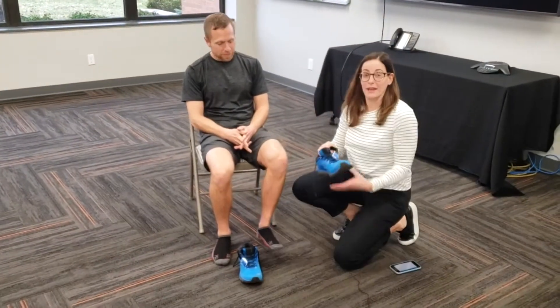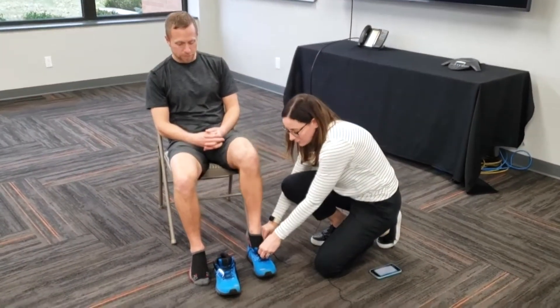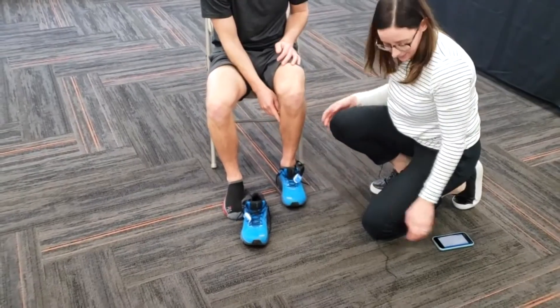Today, we're going to measure Ben. We have set him up with a pair of LoadSoles inside of his shoes. This is a quick and easy setup. Once we fit those insoles into the shoe, he can simply place his foot inside the shoe and tie his shoes.